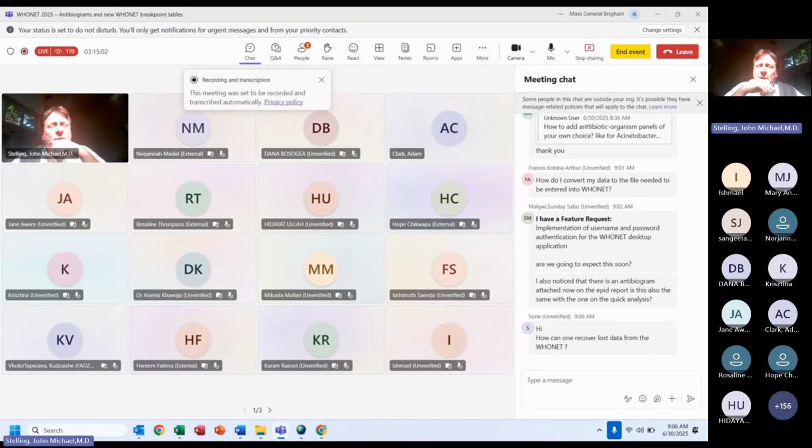We'd also like to offer, and we did this for a CDC project years ago, for auditing. Who did this at what time? What did they access? So a timestamp of user interactions. We'd love to do those features, but we're such a tiny team with a lot of diverse commitments and responsibilities. So it's not a current priority just because we have so many other things that people are requesting. So for our Windows WHONET desktop application, we rely on the traditional Microsoft approach. You protect your computers, username, password, you protect your folders.